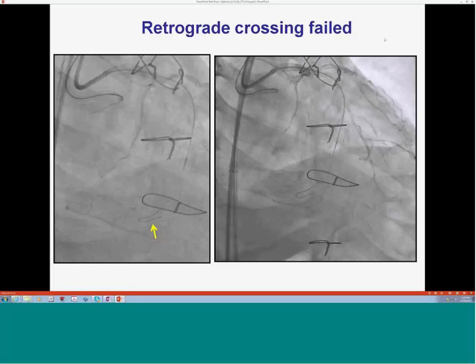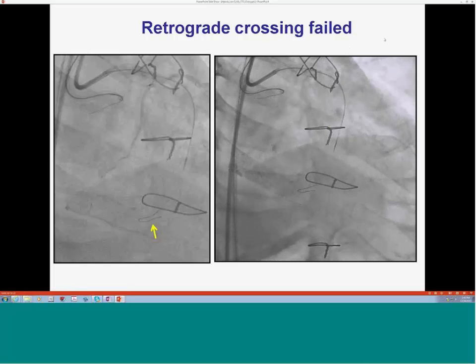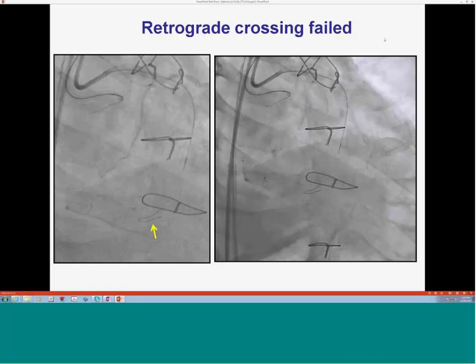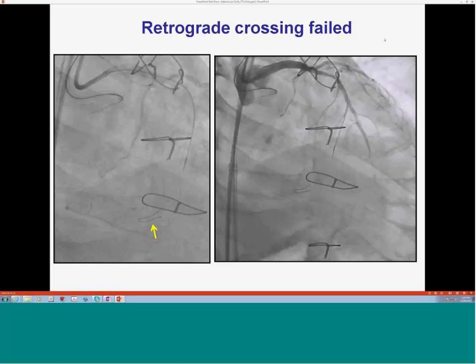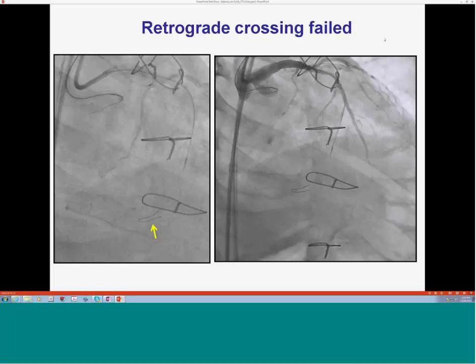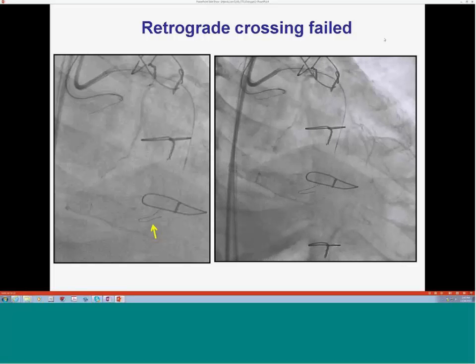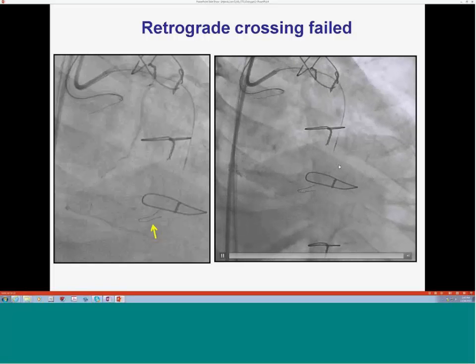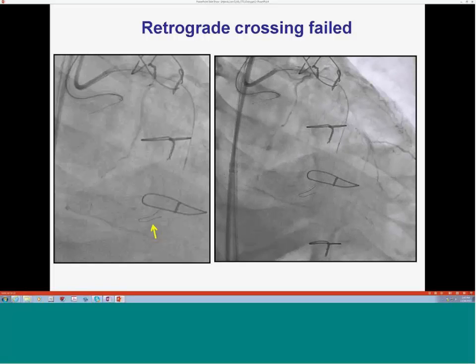The advantage though with retrograde is that we save contrast. So you can do surfing without using contrast, just try with the wire or do injections through the microcatheter. So with the case yesterday actually, in a patient with a creatinine of 2.2, GFR of 35, we did it with 100 of contrast, because with retrograde, once you get down, you don't have to do contrast injections. You can just do the reverse CART, stenting everything without injecting contrast at all.